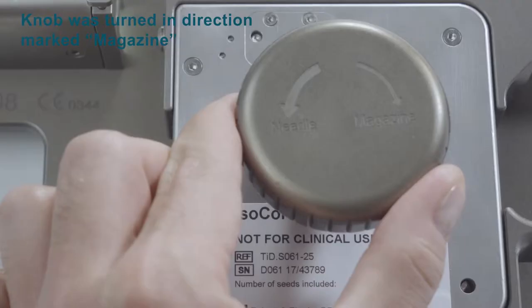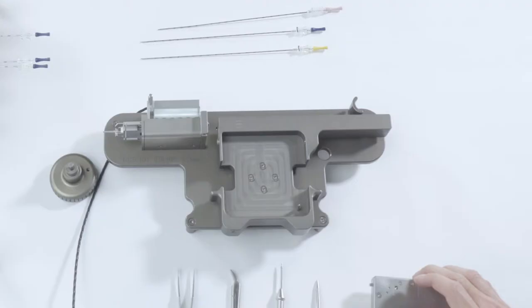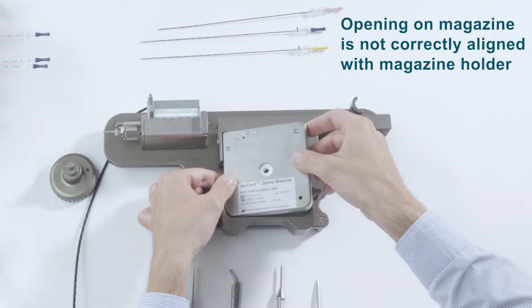Second reason: you have turned the knob in the direction magazine instead of the direction needle. Third reason: the opening on the magazine is not correctly aligned with the magazine holder.